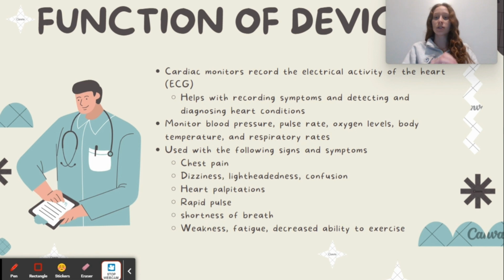And you'll use different cardiac and vital signs monitors when the patient experiences chest pain, dizziness, lightheadedness, and confusion, heart palpitations, rapid pulse, shortness of breath, and weakness, fatigue, and decreased ability to exercise.